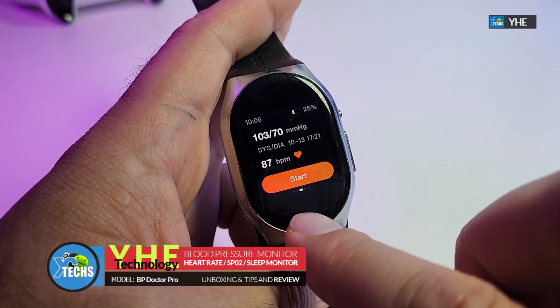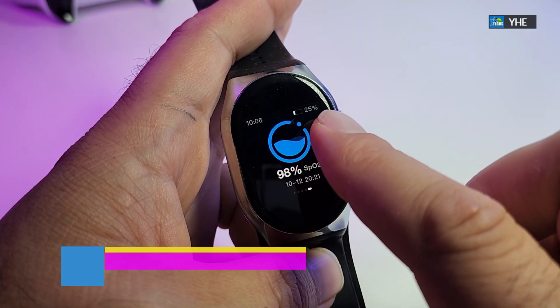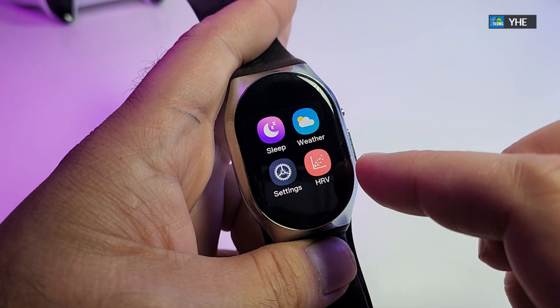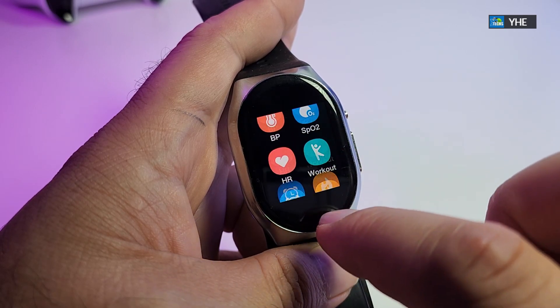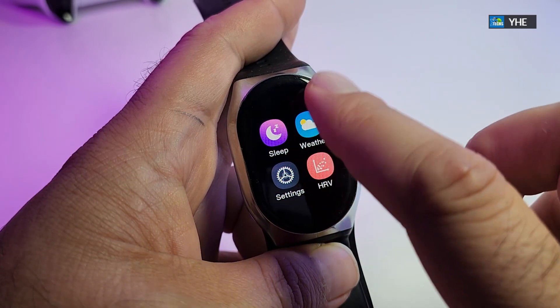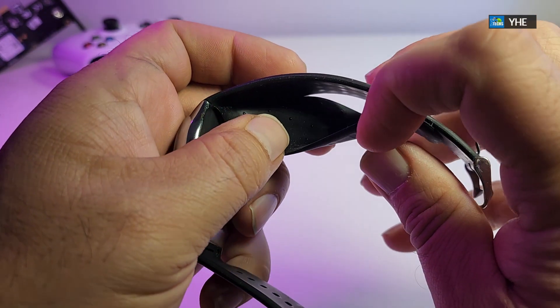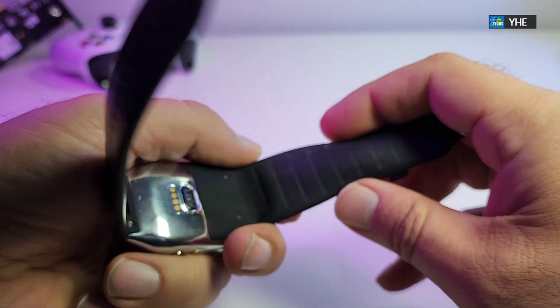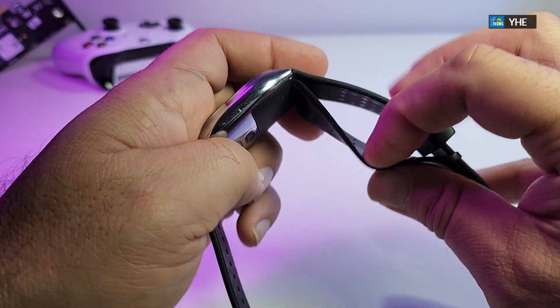It takes accurate blood pressure readings and on top of that tracks your daily health metrics. It starts with heart rate, SPO2, and auto sleep monitoring. This is a real breakthrough to give you everything accurately. If you see at the bottom, it has a miniature air valve that can inflate, and that way it checks your blood pressure on the smartwatch.